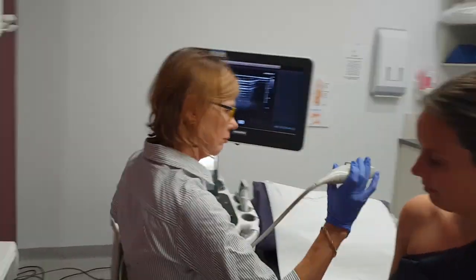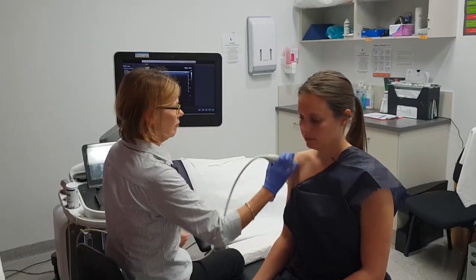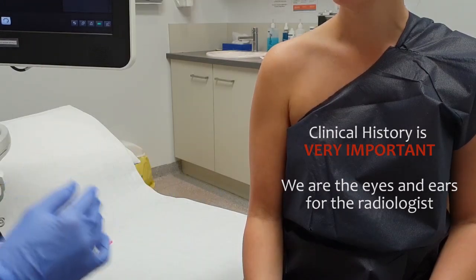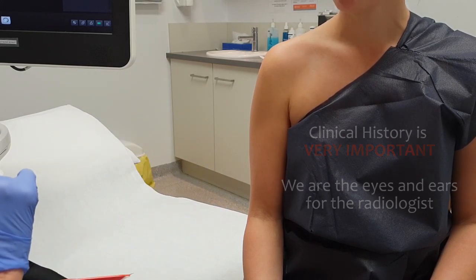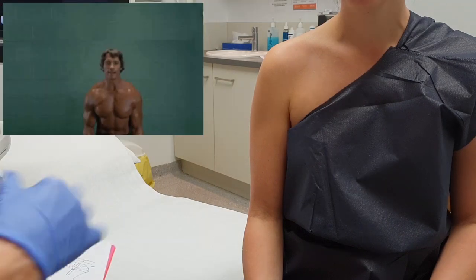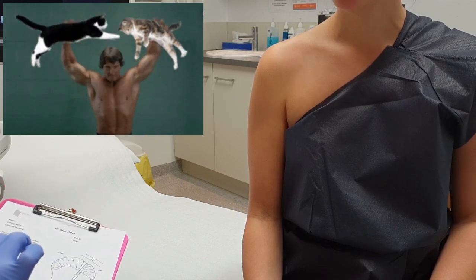So we're going to scan a shoulder now, and when I get a shoulder patient, I always inquire about whether they've injured their shoulder or not. So, Ms X, have you injured your shoulder or have you just had some pain sort of sneak up on you lately? Do you do a lot of exercise, like do you go to the gym and do a lot of weights or anything like that?